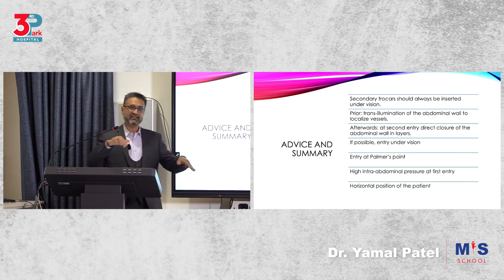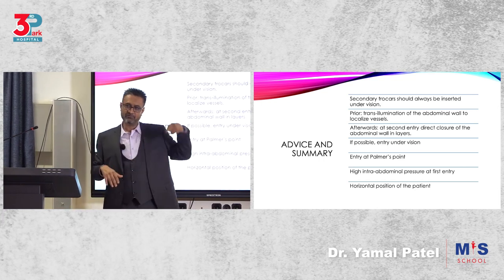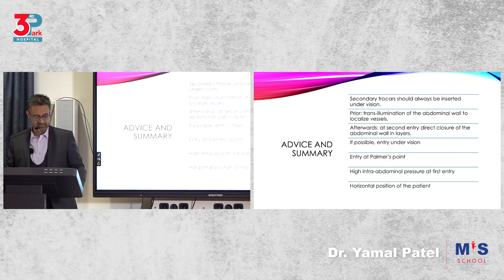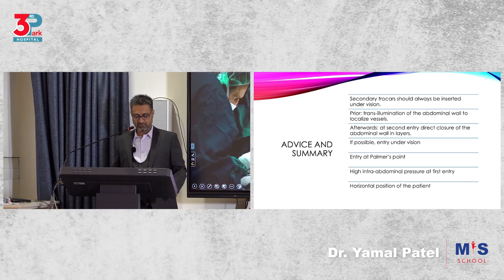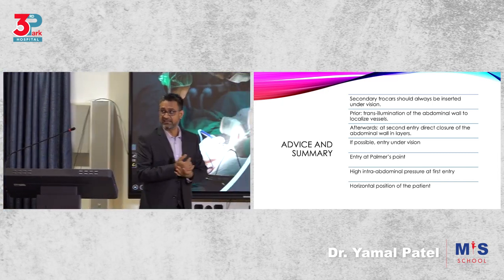For the secondary ports, yes, you can give a head low so that the bowel has moved away before you put them in. But the primary port is always in a horizontal position. Be careful; this one will be in those difficult entry cases.